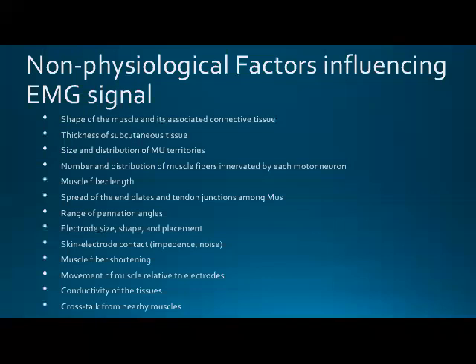You might have muscle movement that's separate from the skin movement, which can occur in really rapid contractions that you would see during running or some cycling exercise. Any cycling study that utilizes EMG or MMG will usually control for cadence to ensure that the rate of contraction is consistent across the entire exercise bout and across the subjects. That will in part account for the movement of the muscle.